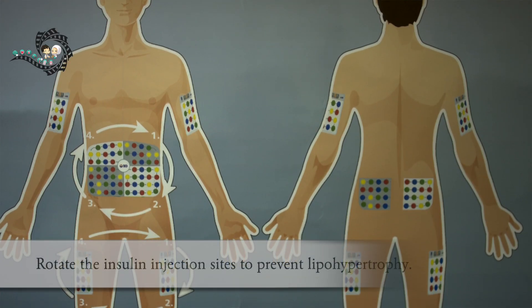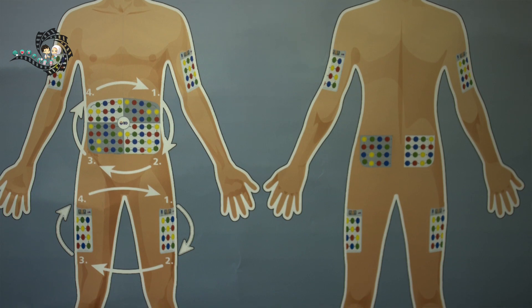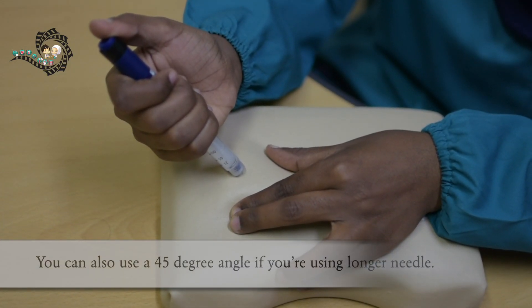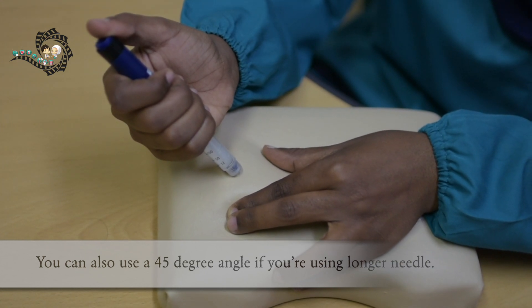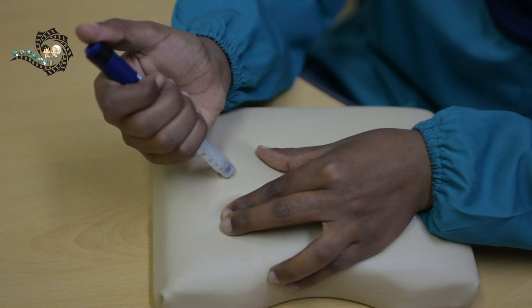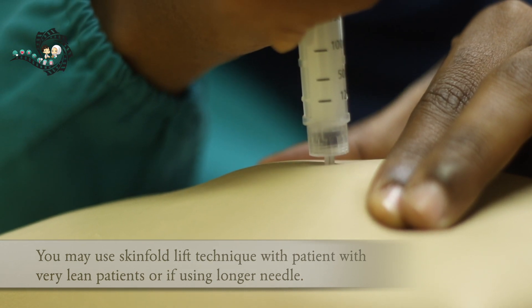If no insulin is coming out after 3 tries, attach a new needle and try again. You should rotate the insulin injection site to prevent lipohypertrophy, which can interfere with insulin absorption and cause poor sugar control. Avoid injecting insulin near scars or hypertrophied tissue. You can also use a 45 degree angle if you are using a longer needle, to make sure that insulin is injected in the subcutaneous tissue instead of the muscle. You may use the skin fold lift technique for very lean patients or if you are using a longer needle. Insulin pen needles cannot be reused and should not be kept with the pen attached.